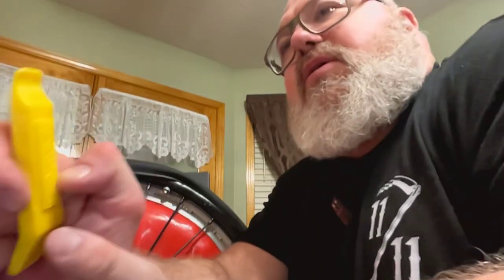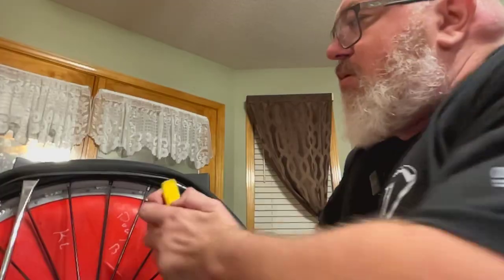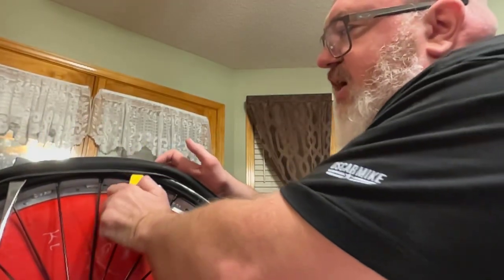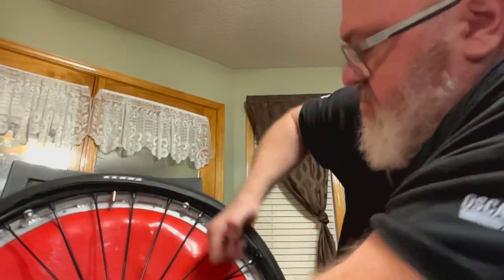And then I take this tool. See how it's angled? Whoop, there. So that I slide in, I put the hook side out, slide it in, grab it. Hopefully not completely kill my hand doing it. And I basically just work that tube all the way out, or the tire all the way around to the other side.